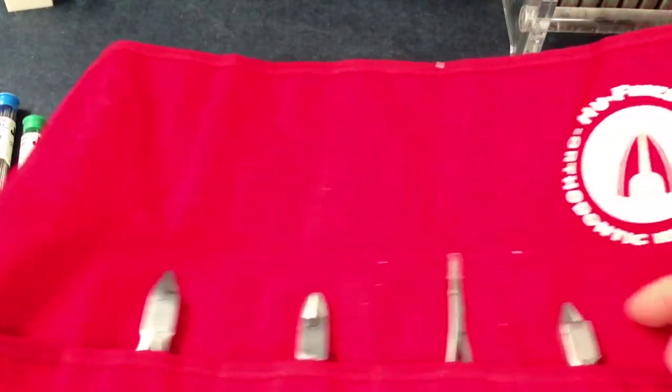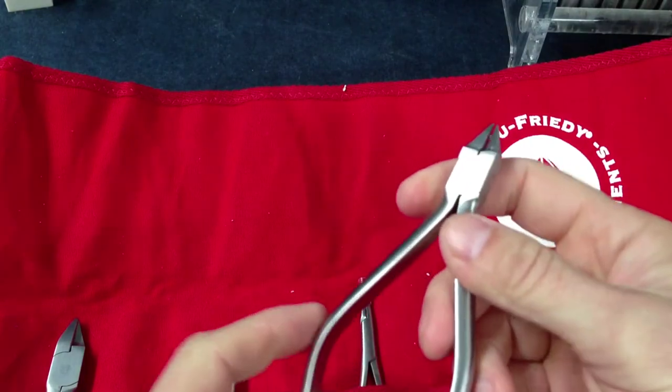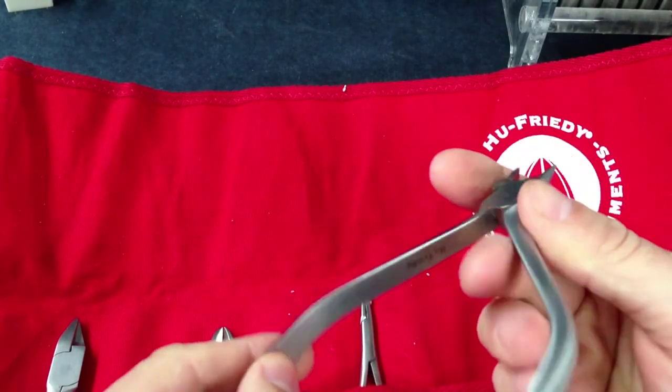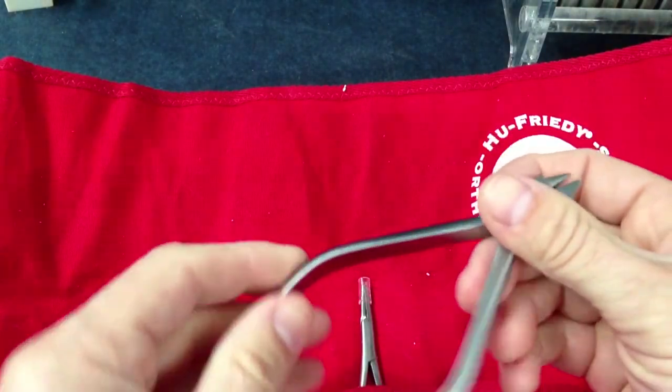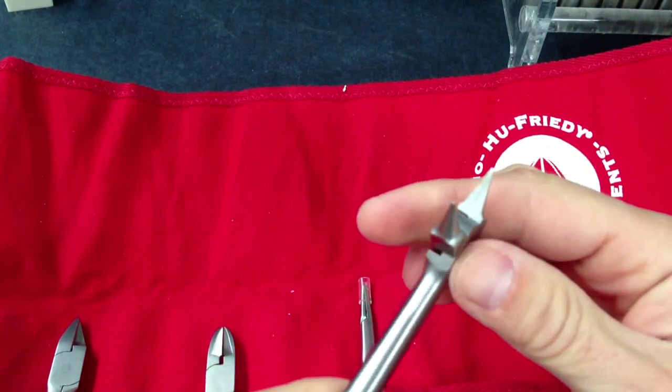The pliers you will use are your bird beak pliers, specifically the Hu-Friedy 678-304 bird beak pliers. They are non-serrated.